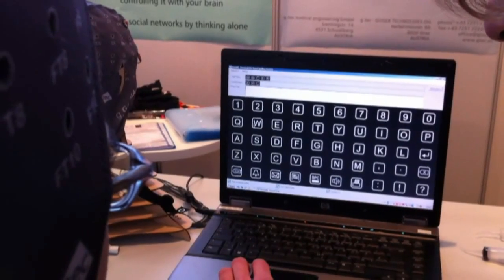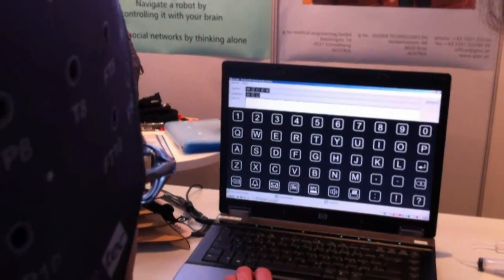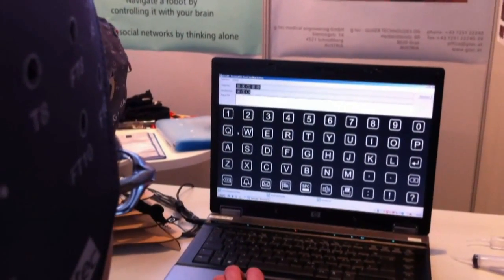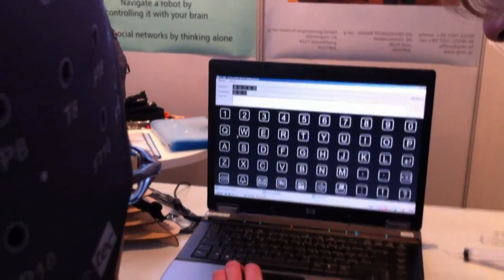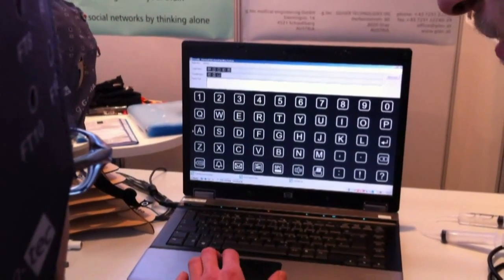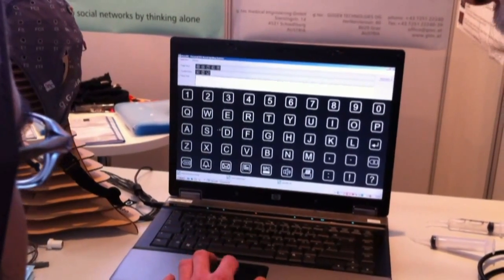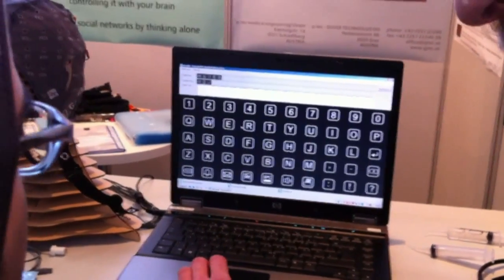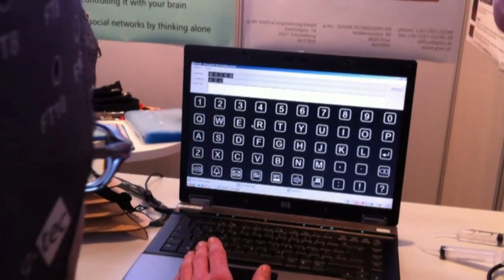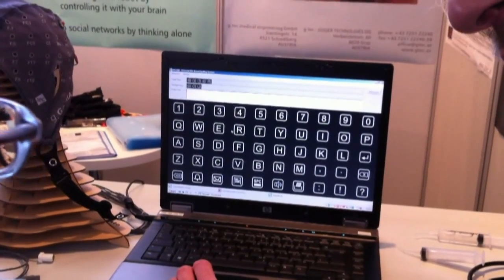First the W will be highlighted, and then the rows and columns start to flash randomly. Your task is just to concentrate on the W. It takes about 40 seconds for the W, then there will be a little break, and then the A will be highlighted — you just concentrate on the A, again for 40 seconds. Then comes the T, the E, and the R. So the whole process takes about four to five minutes, and then we have enough EEG data.